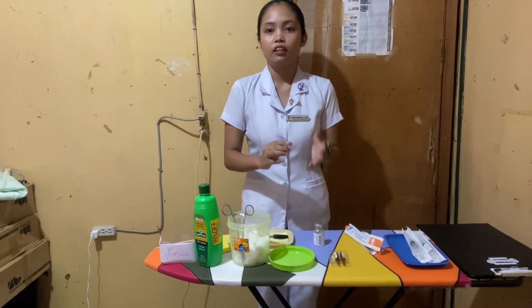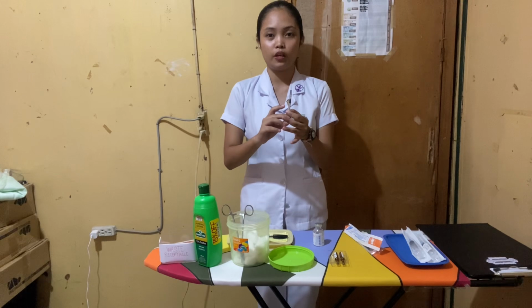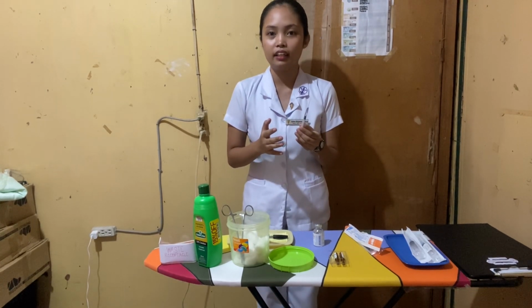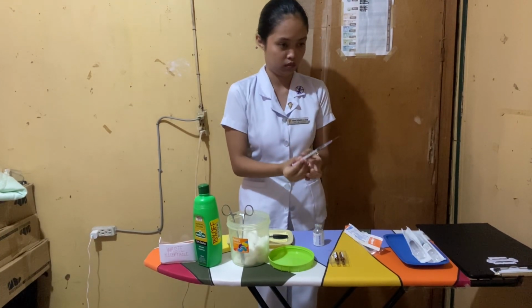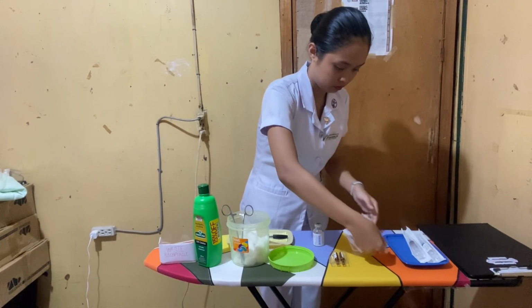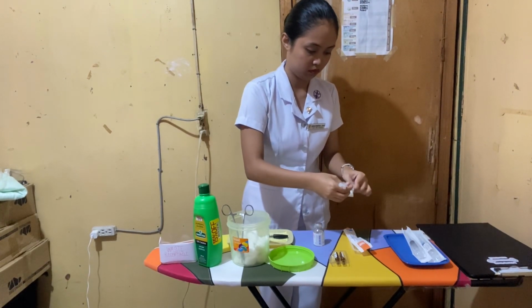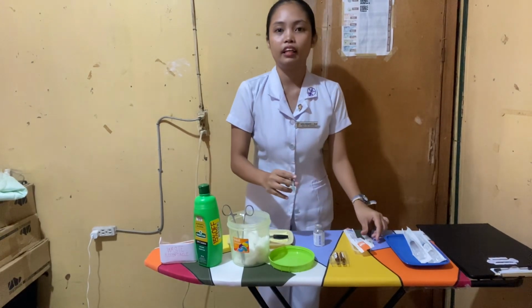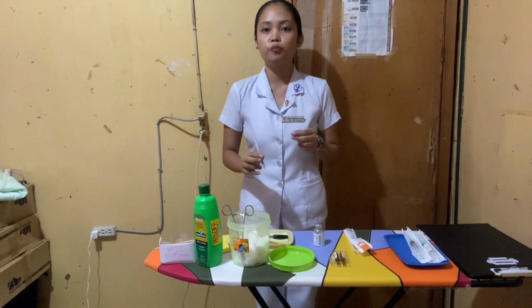After doing that, if you see an air bubble inside the syringe, then we can lightly tap the barrel to expel the air bubbles. And then I'm going to remove this aspirating needle and discard it in the waste receptacle to avoid needle prick injury.